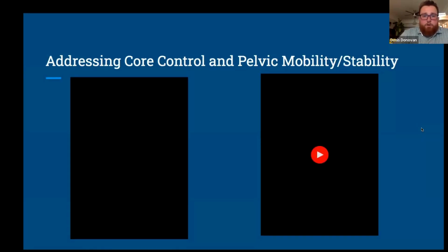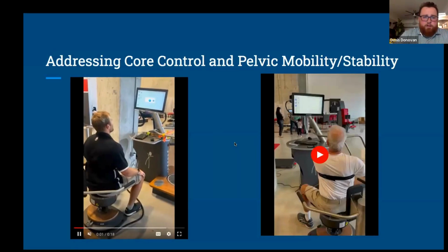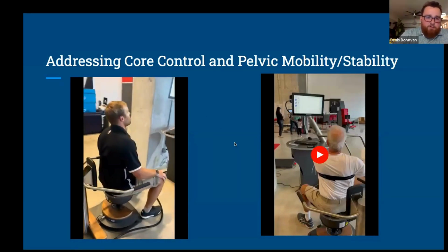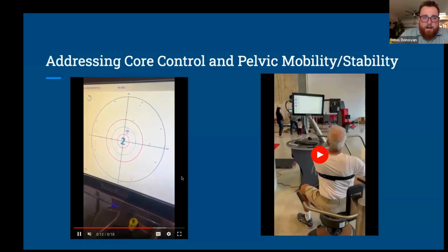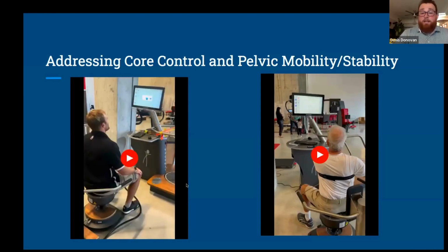All right. So these are just two really quick videos. I know we talked about rotating the pelvis around a stable trunk, and rotating a trunk around a stable pelvis. These are two things I do with all my golfers. Not really Tecar related, but in this video, I'm asking this gentleman to rotate his pelvis around a stable trunk. He is trying to trace that line. We have a trunk sensor on him, which is going to tell us just how well he is able to move his pelvis in all directions, and where he starts to compensate by using his trunk.